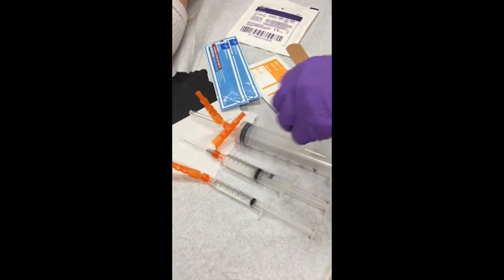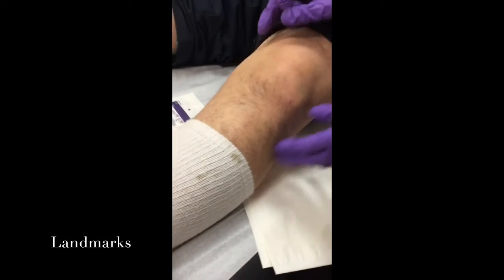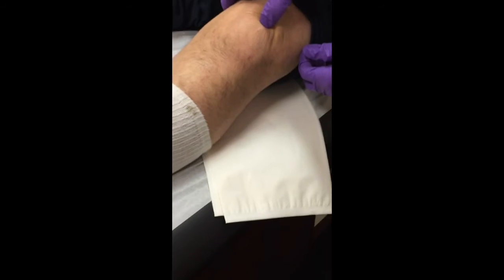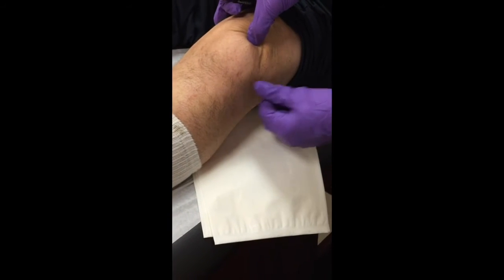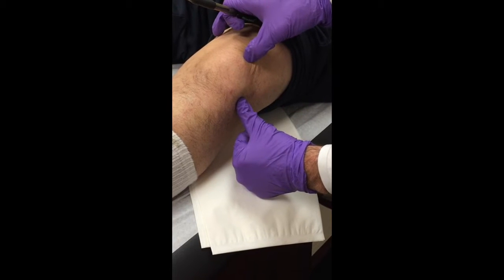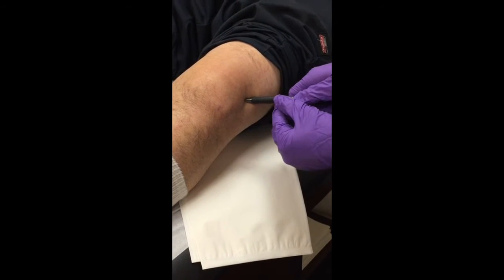Now that we have everything lined up, we put the patient supine laying down, making sure their leg is nice and relaxed. We're looking for the superior border of the patella and the lateral border, and you make basically a perpendicular line from that point and then go just a little bit more perpendicular — that's typically your spot.